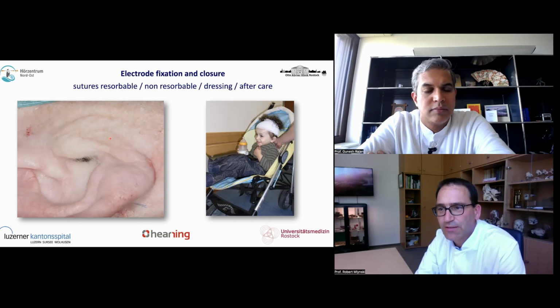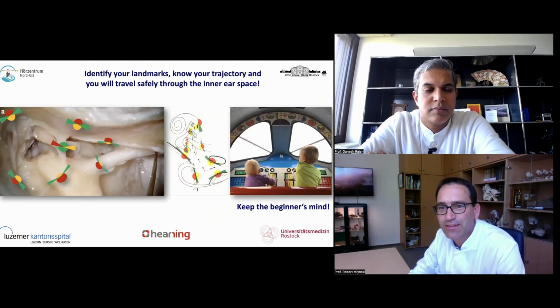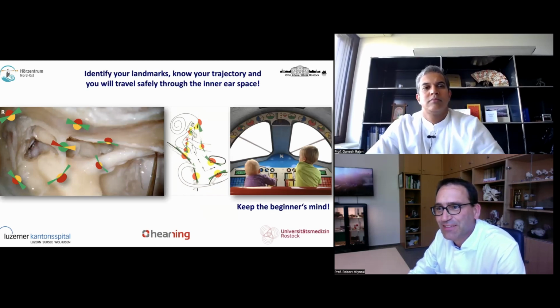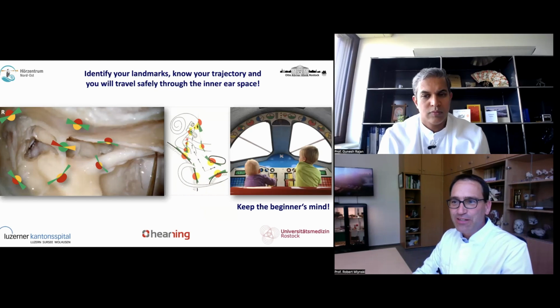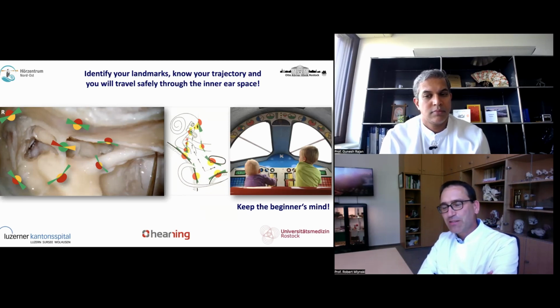I think there's a need for a take-home message, and then we can discuss what to do. So space, light, and landmarks is important to see and travel through inner ear space. And I think what you said, that we should always keep the beginner's mind, do how you have learned it 100 times and then start thinking of it if you can improve it.